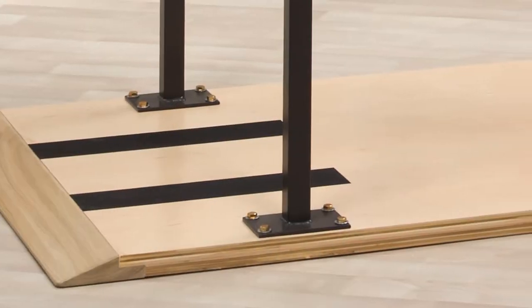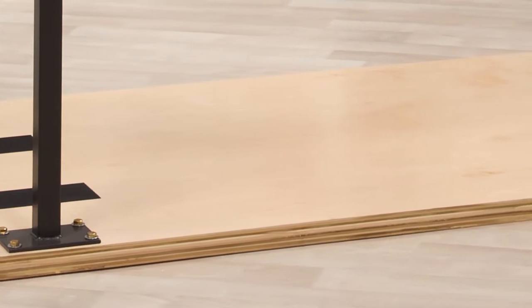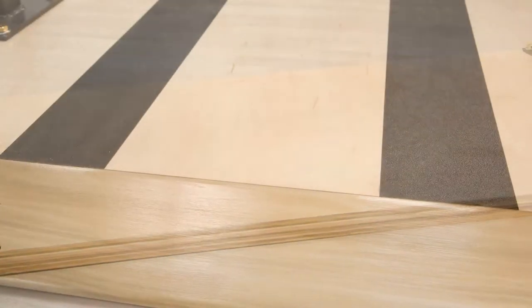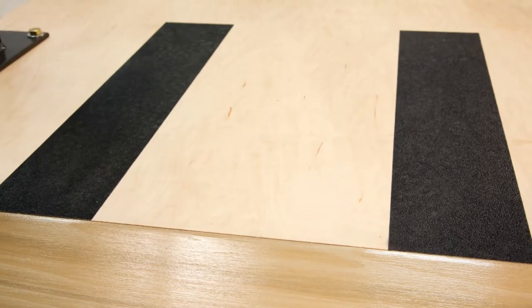We start with platforms made from one and a half inch hardwood plywood. We topcoat it with an ultra durable UV cured satin finish and add safety tread at both ends so patients don't slip when starting or stopping.